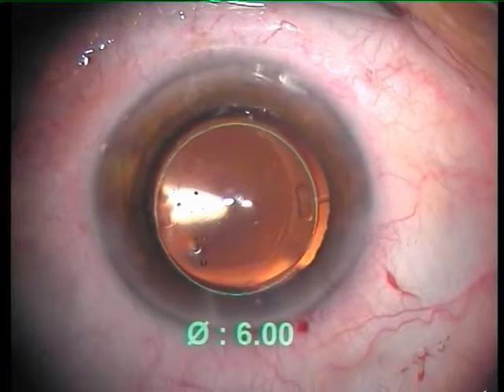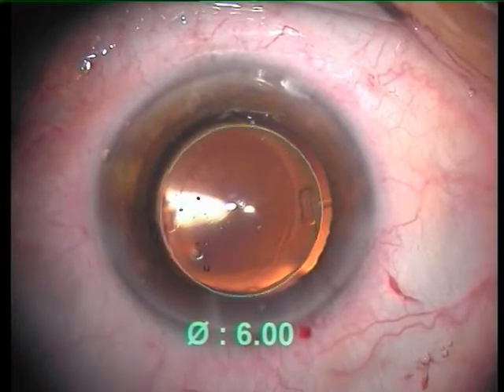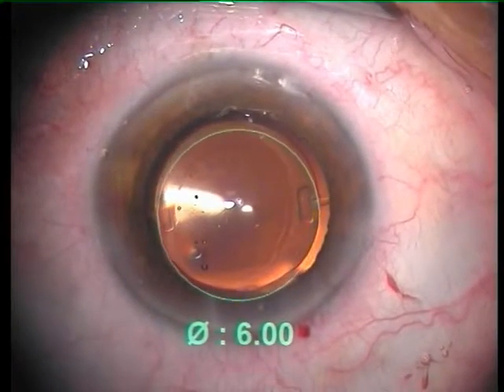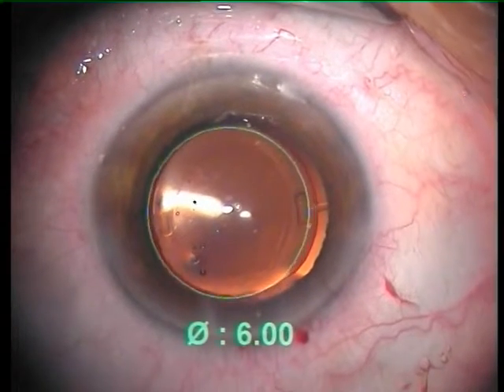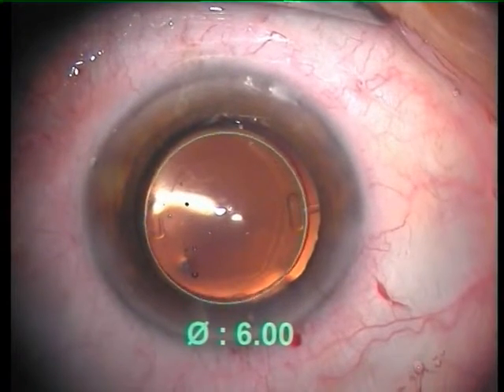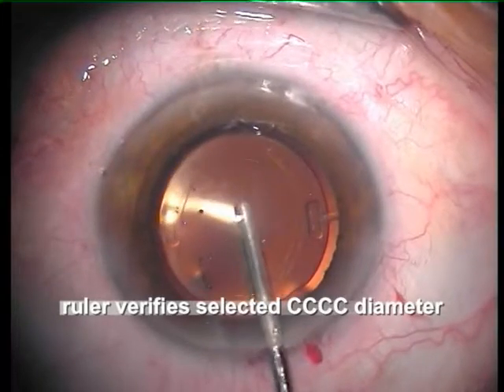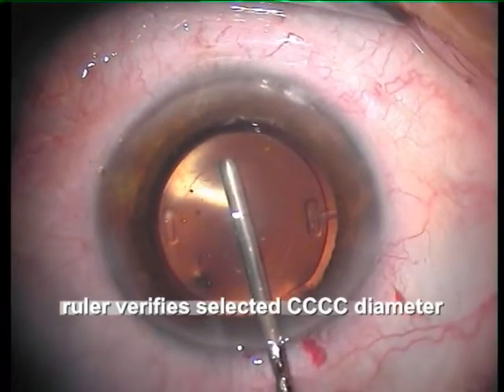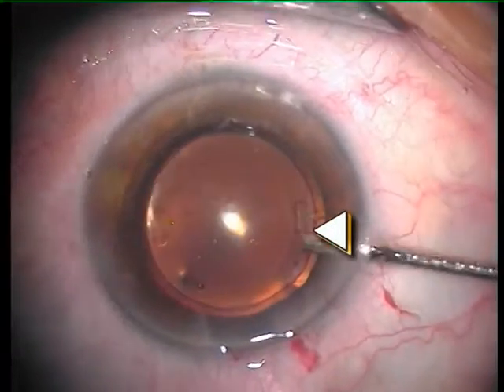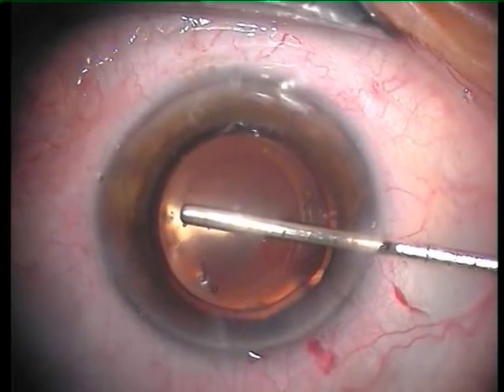To objectify the size, position, and centration of the customised CCC, this new system allows the projection of a circle with a freely selectable diameter into the eyepiece of the surgical microscope. The imaging media, like the patient's eye and surgical microscope configuration, are incorporated into the calculation of the various dimensions. In this case, with a larger rexis overlap, the customised CCC is perfected with great confidence using the data projection technology.